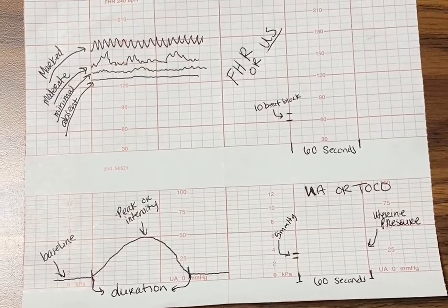Rebecca. And we're going to be talking about fetal heart monitoring and the categories and how they fluctuate, 1 through 3. Come with us on a journey. Okay guys, we're gonna teach you how to strip.